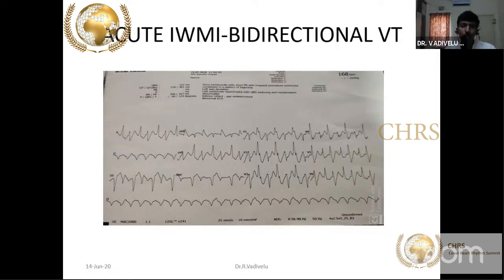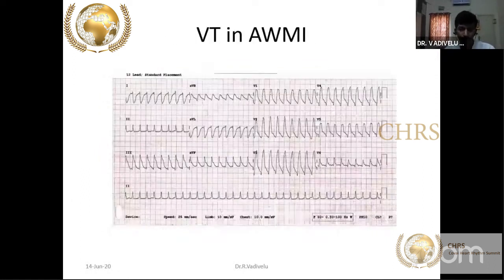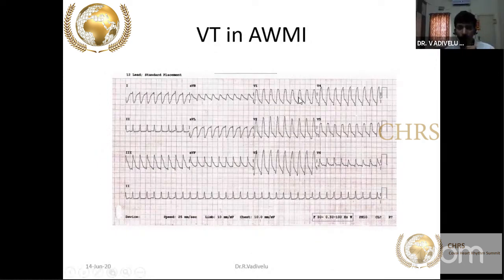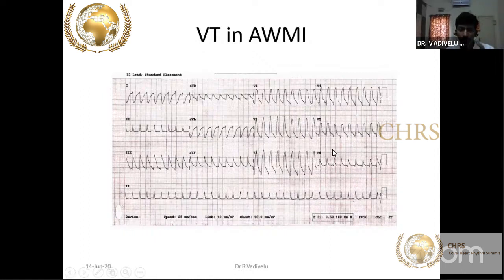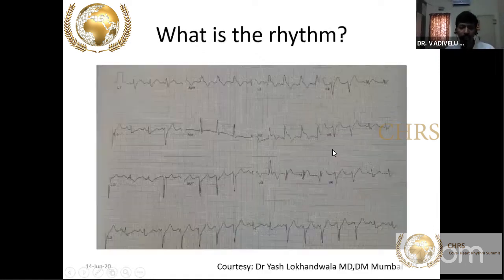Monomorphic VT usually occurs in the setting of old MI. In the setting of old anterior wall MI, if you see V1 all upright and regular, and V4 also all upright and regular, this monomorphic VT suggests scar VT.